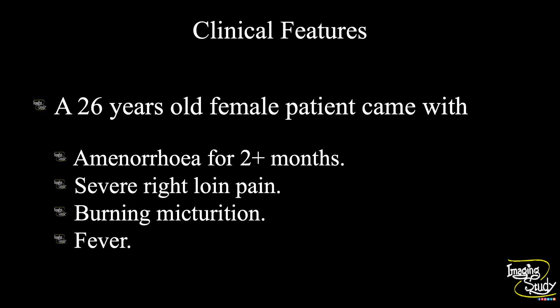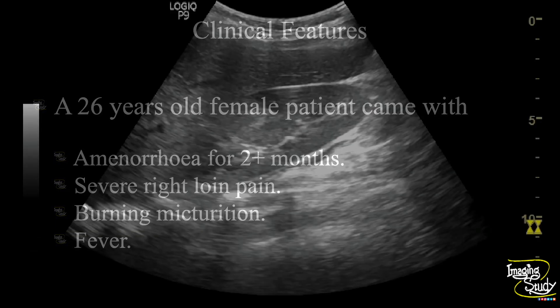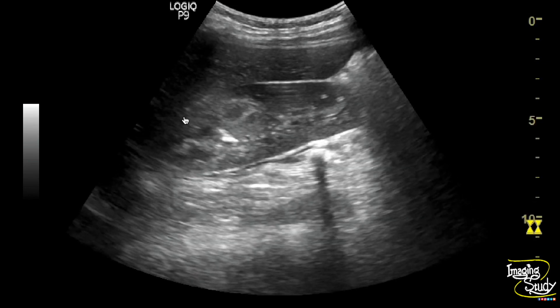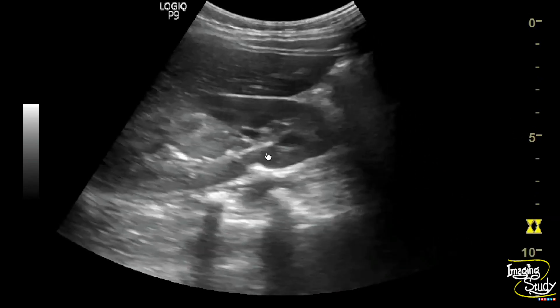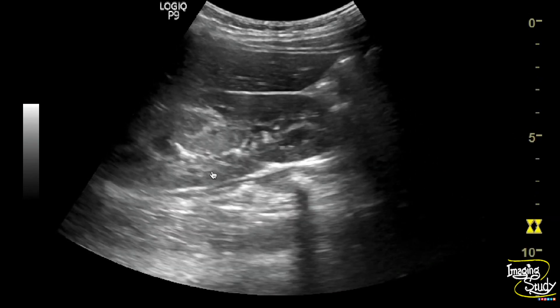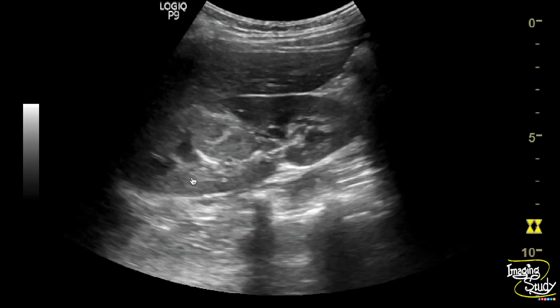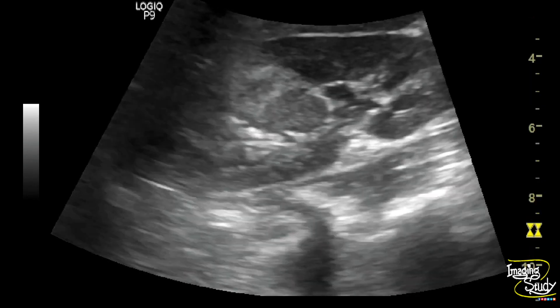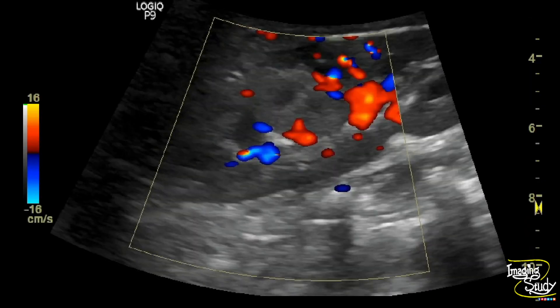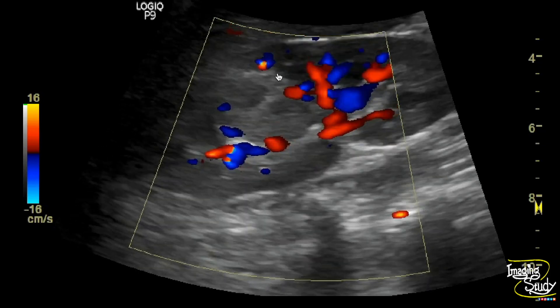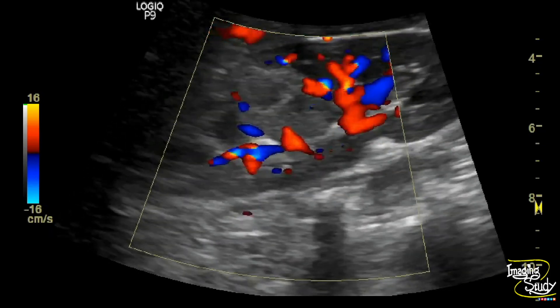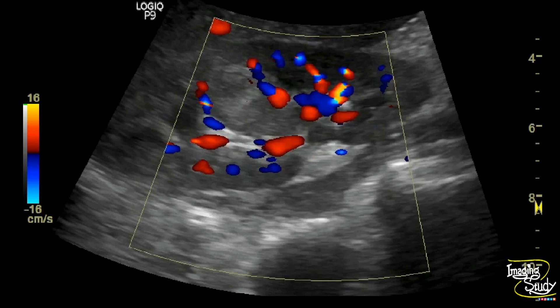Let's see what we have got on ultrasound. Here you can see the longitudinal section of the right kidney. You can see a heterogeneously hyperechogenic area at the mid part of the renal parenchyma. On color Doppler, this lesion is displacing the adjacent blood vessels, and there is no internal flow noted.